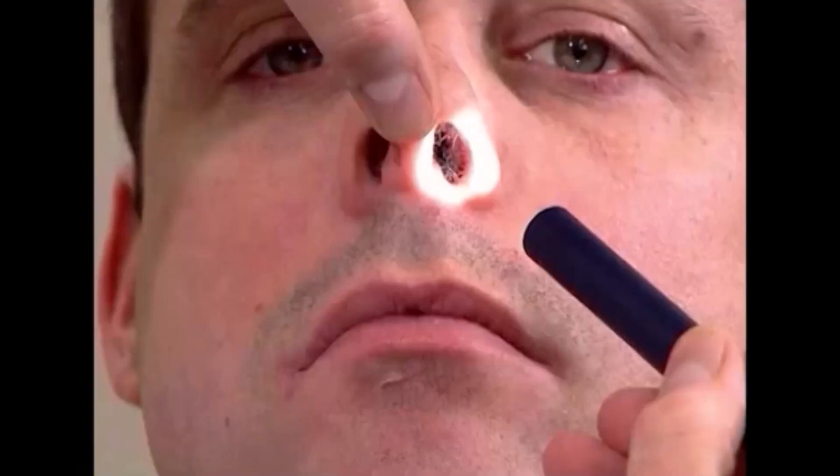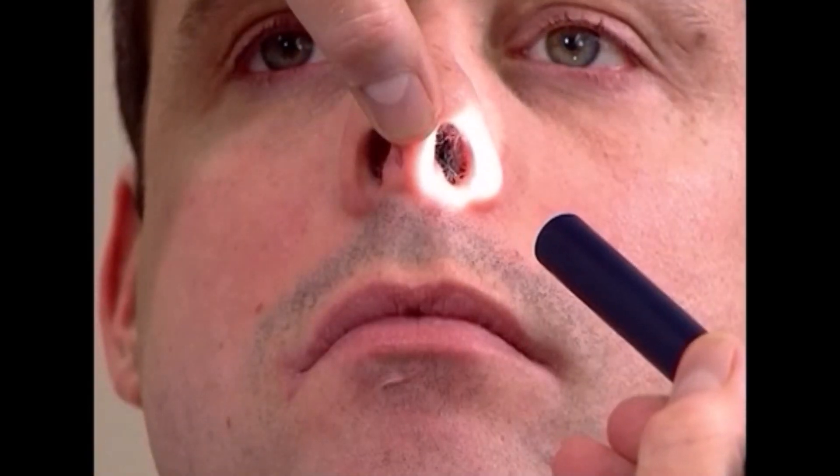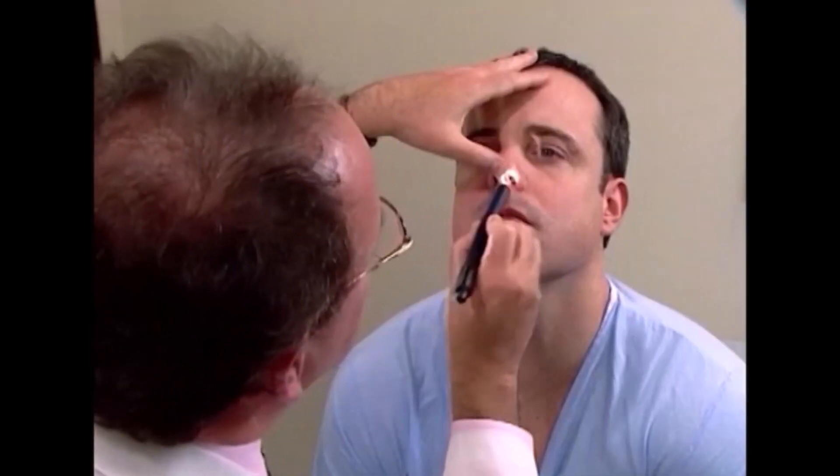Evaluation of the nose is done by having the person extend the neck, using a light source, and elevating the tip of the nose, looking in the nares to see the position of the septum, and if there's any discharge or separation of the septum.